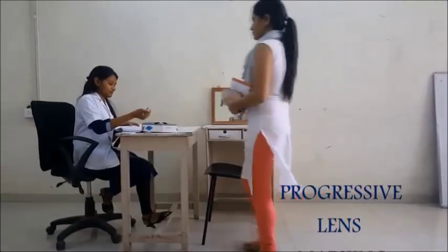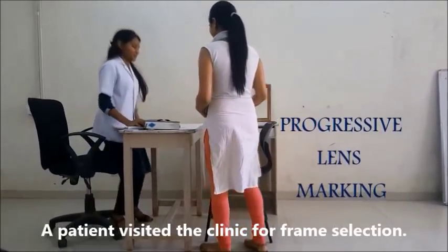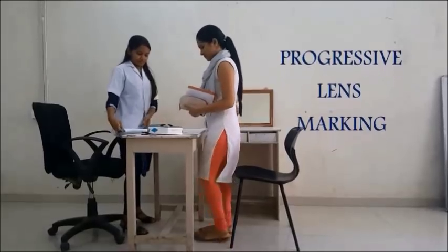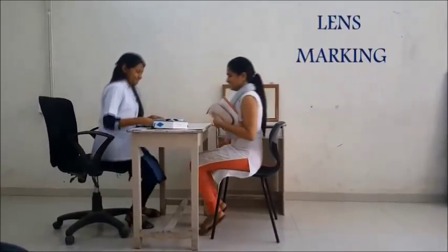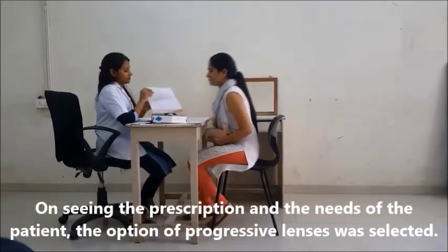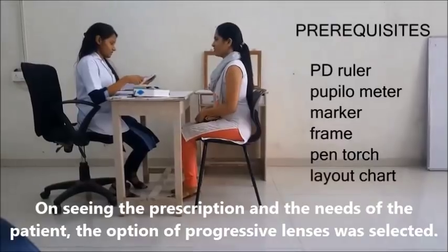Progressive lens marking. The patient visited the clinic for frame selection. On seeing the prescription and the needs of the patient, the option of progressive lenses was selected.